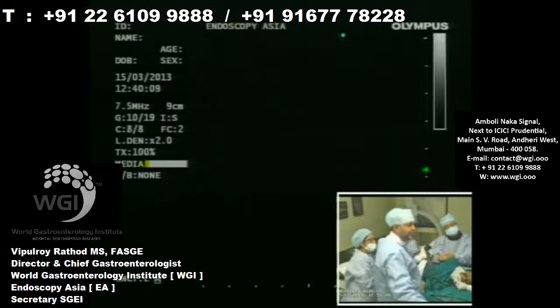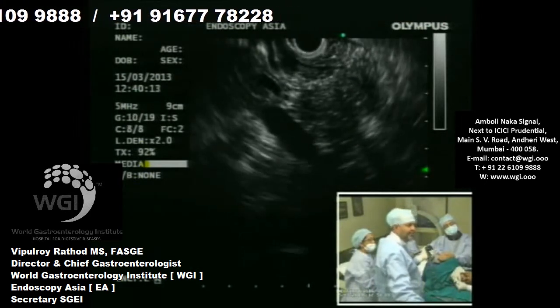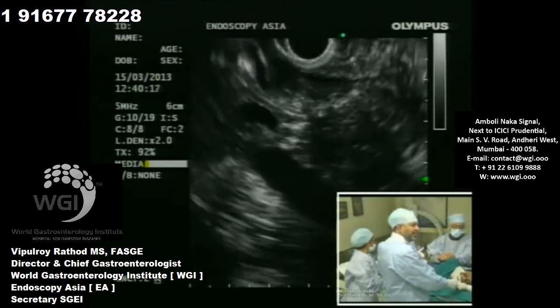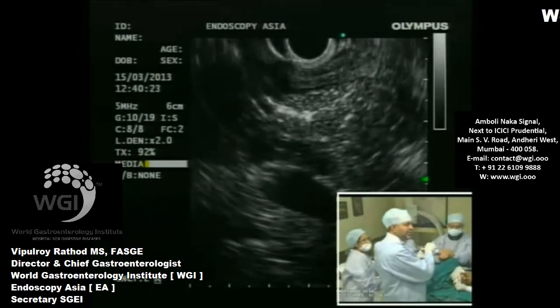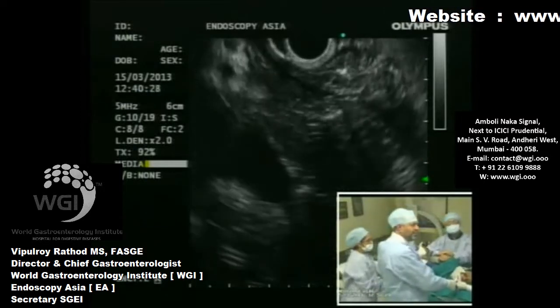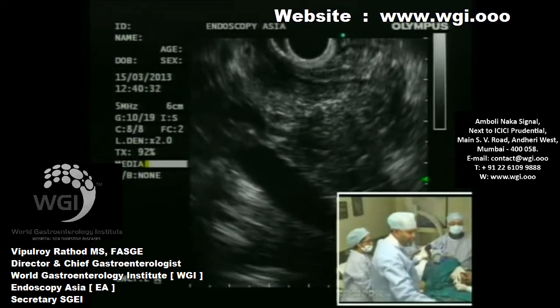So now we will switch over to frequency. I prefer to start at 5 megahertz. I'm doing 5 megahertz, and this is a linear. We went straight with linear purely because we wanted to see if we will need an EUS FNA from the head area. So I'm seeing a hypoechoic pancreas.